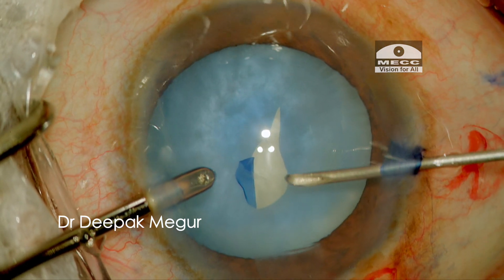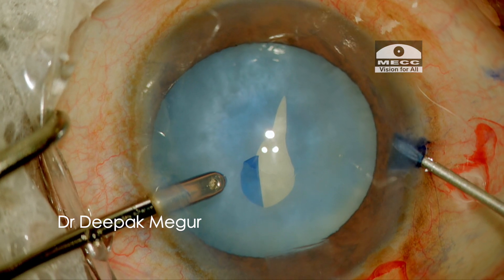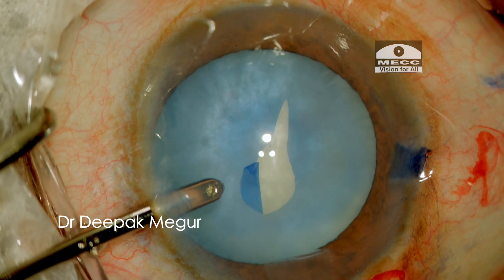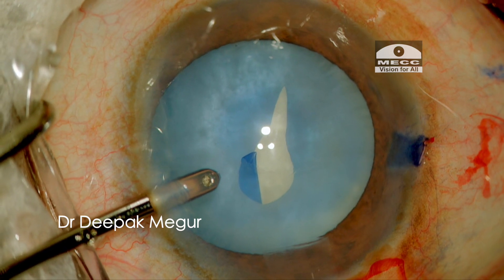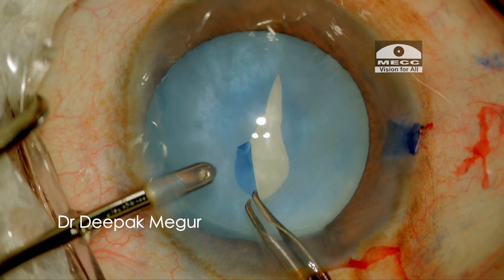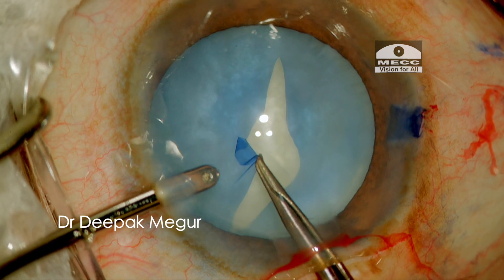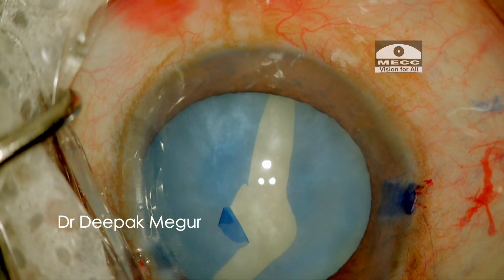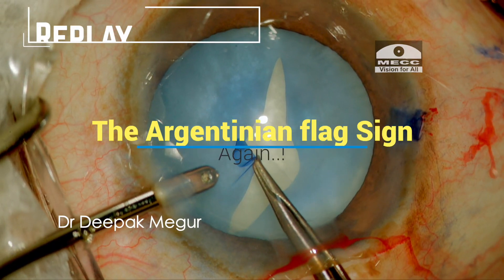A radial extension suddenly appears from the opposite end of the tearing flap. Somehow it stops in between. I'm thinking I still have a chance to retrieve this — the chamber is still alright, not shallowing. My dispersive OVD is still holding the chamber in place. I still believe I can retrieve the rhexis back and go in with my forceps. Alas! So finally I end up again having the Argentinian flag sign, but this time it was really slow.